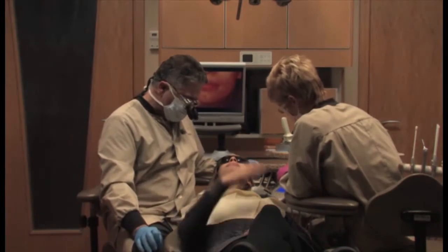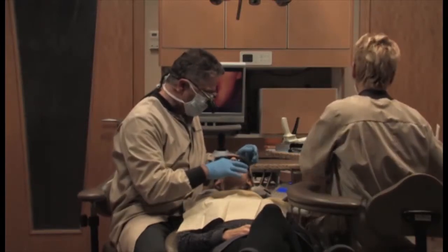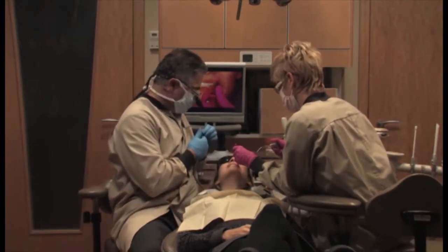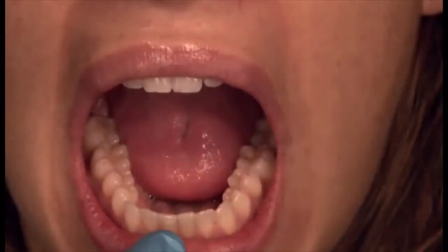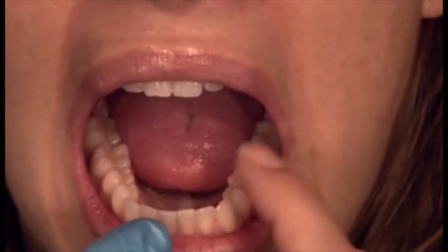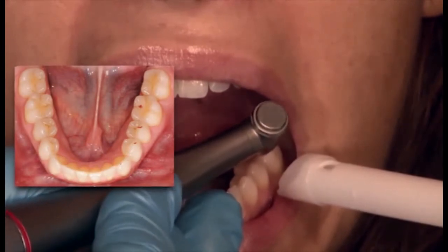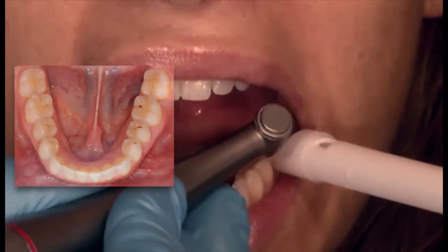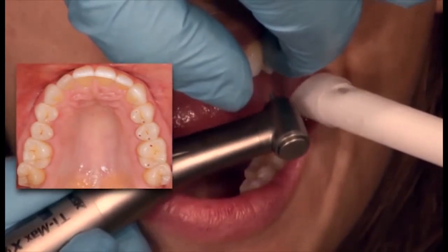Where do you feel the contact now? On the left side. We'll mark the left side. And I'm going to pick up a brownie point and say, which tooth do you think it is on that side? That one. And all I'm willing to touch are anything's on inclines, central fossas, not cusp tips. And then I'll come back and ask if it made a difference.